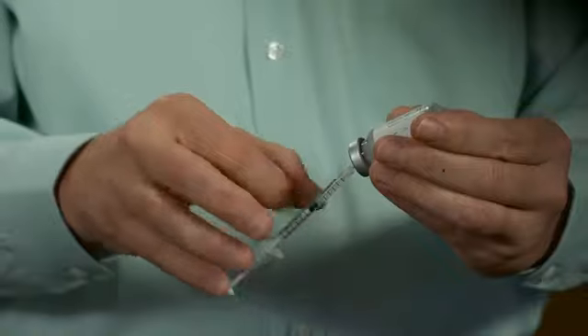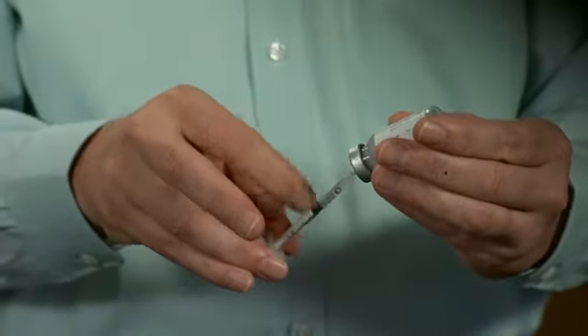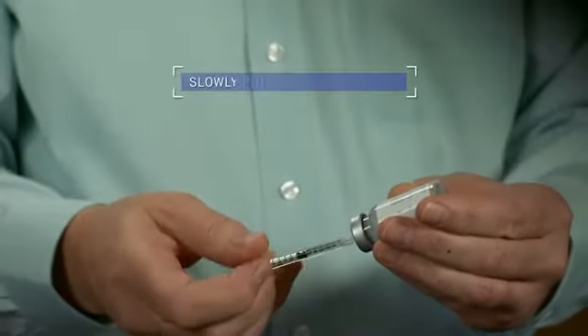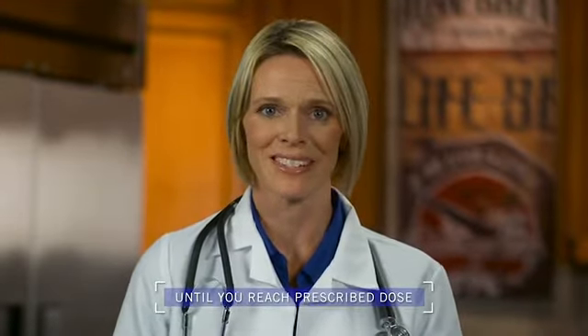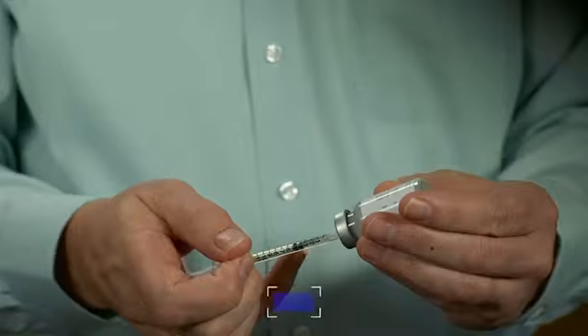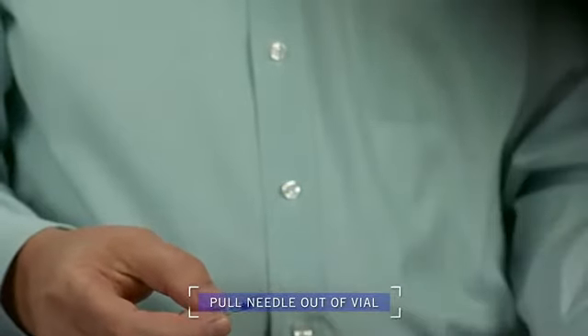While you still have the needle inserted in the vial, look for any big air bubbles in the syringe. If you see any, just tap the side of the syringe gently with your finger to release them. Now slowly push the plunger back in until you reach the prescribed dose — in this case, four units. Take your finger off the plunger and gently pull the needle out of the vial. The syringe is now ready for the injection.